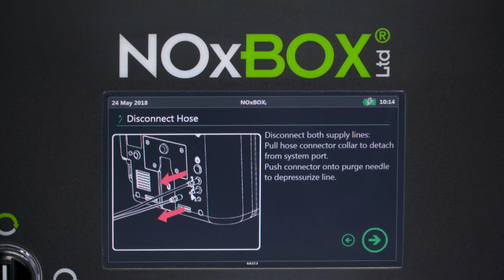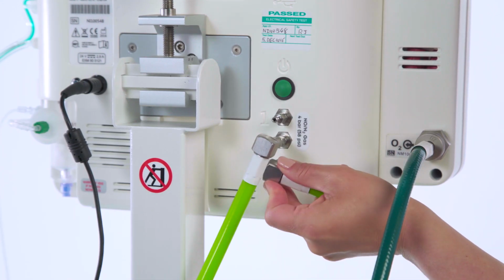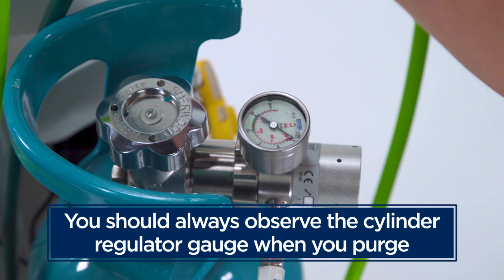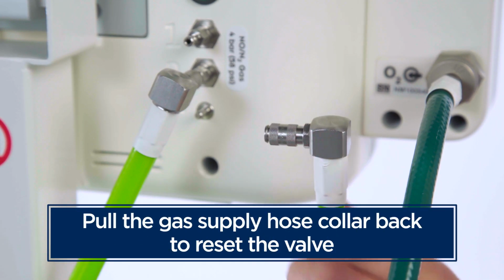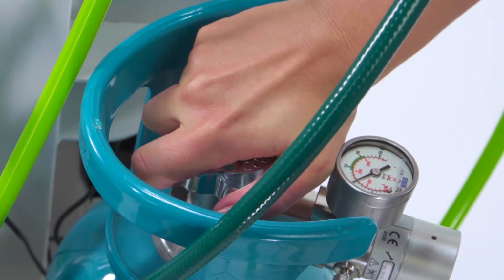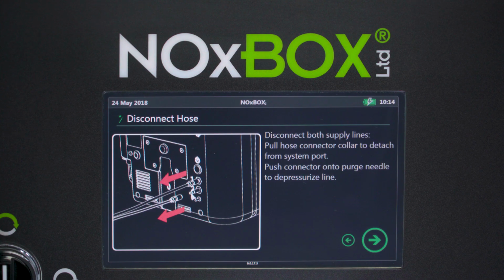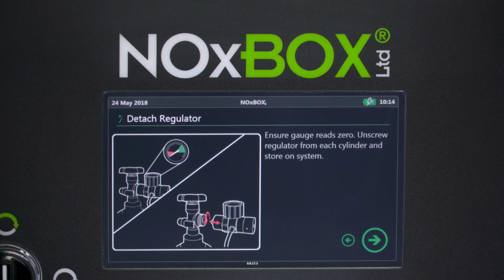Disconnect and purge the nitric oxide gas supply lines. You should always observe the cylinder regulator gauge when you purge. If the needle remains stationary, pull back the collar on the nitric oxide supply line to reset the valve and check to make sure the cylinder valve is fully closed. Once the cylinder regulator indicates 0 bar or PSI, disconnect the regulator from the cylinder for storage.